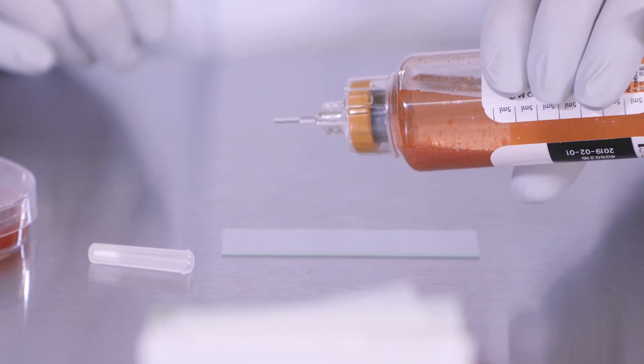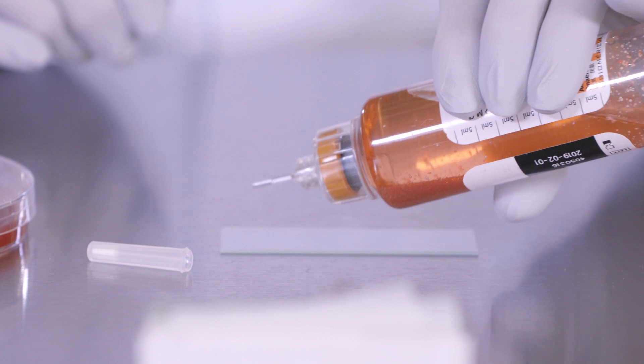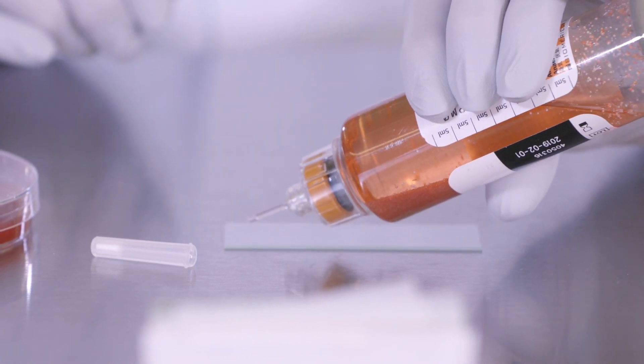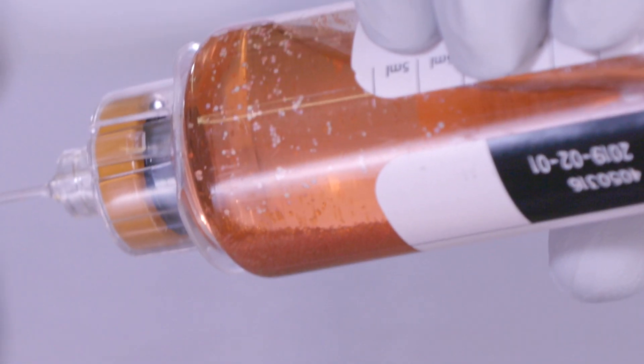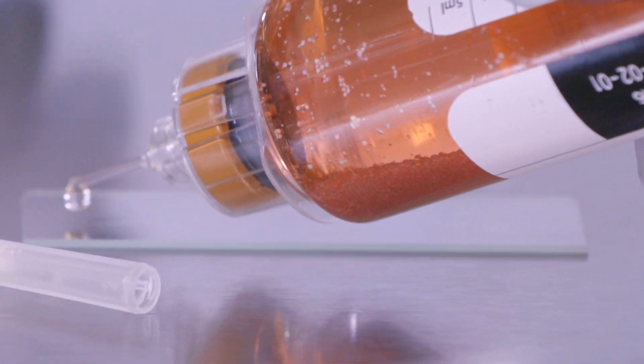For bottles that contain resin beads, angle the bottle so that the resin beads gather along the side of the bottle. This prevents the resin beads from obstructing the SCU-2 piercing tip.